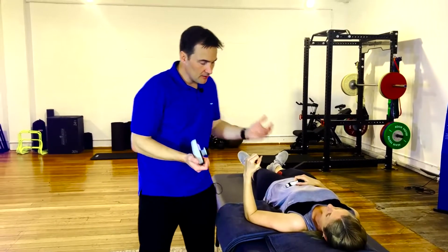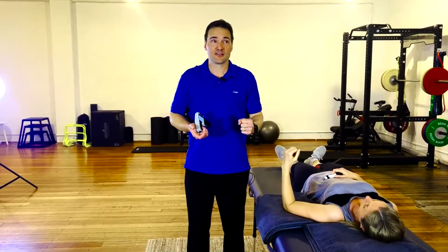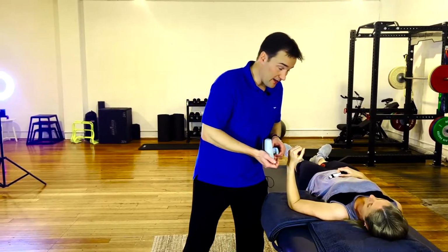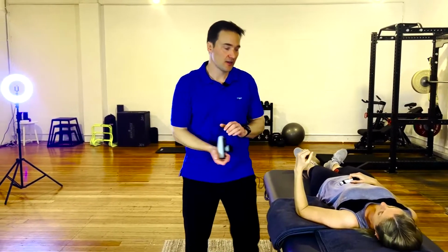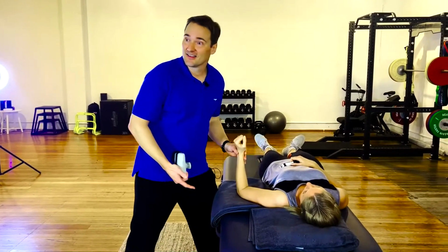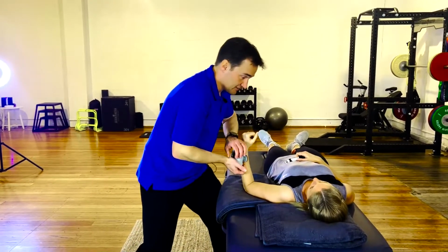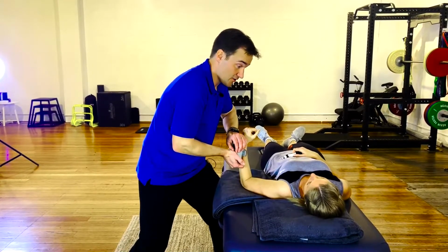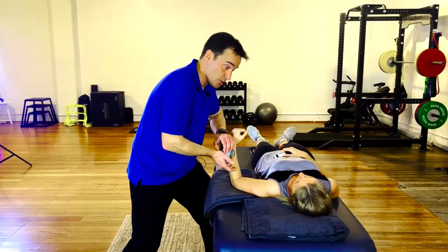A break test, look, people have their preferences. There is some literature about both of them. A break test, people would argue, you're actually just testing the point at which they break. The whole point of them is to measure peak torque or peak force. So if you can do it with a make test where it's based on the person's willingness to push to their limit against something that's not moving, or if you need to move them to generate a peak and introduce some eccentric contraction on the way out, then that's what you do. A break test is simply the same thing. You're going to match my resistance, and then at the end, I'm going to beat you. I'm going to keep going till I beat you. So you might have some instruction like that so they know what to expect.